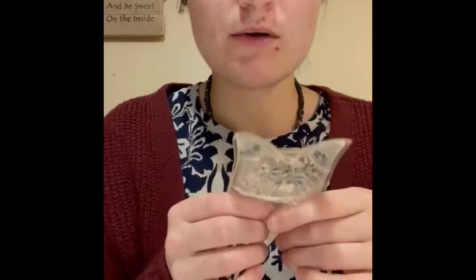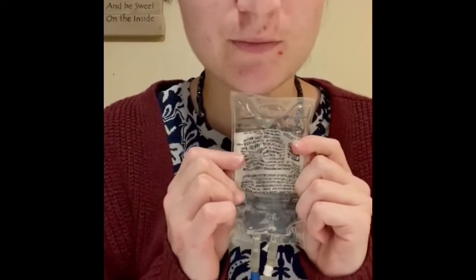So I've got my solution set ready, and I'm going to take my bag and my solution set. I'll prime my solution set with the medication, and then I will attach it to the IV that has been just inserted a few minutes ago, and then program the pump for the 6.17. Then I'll document it and clean up my stuff.